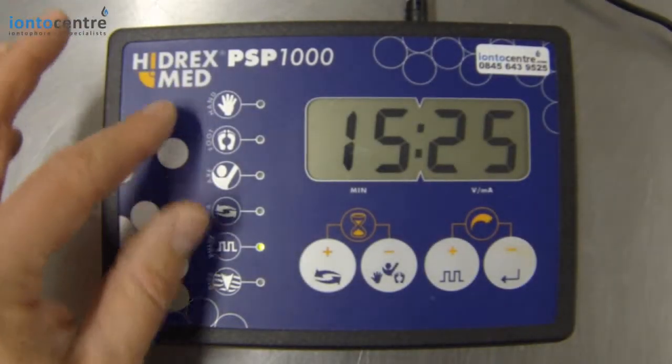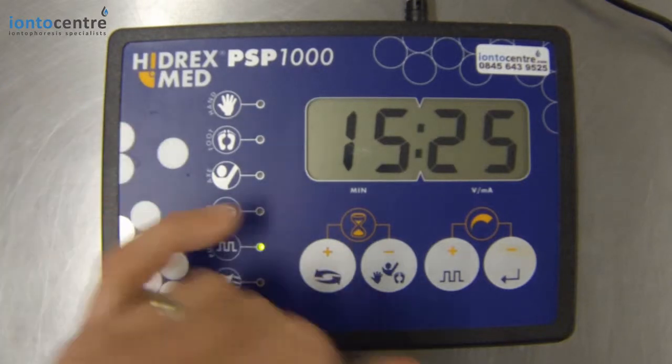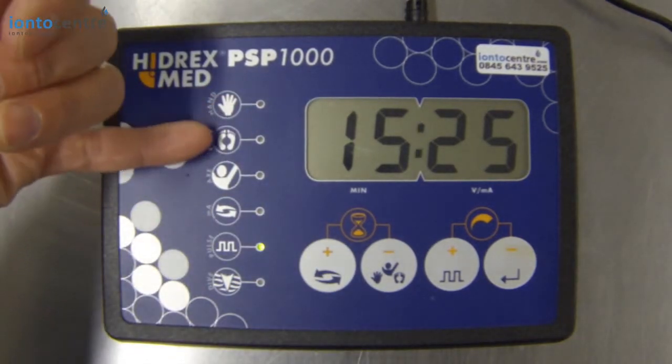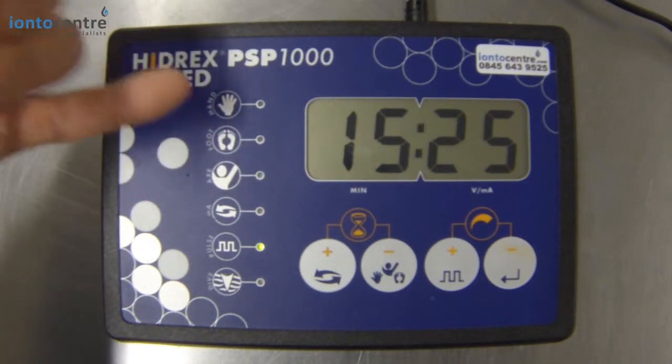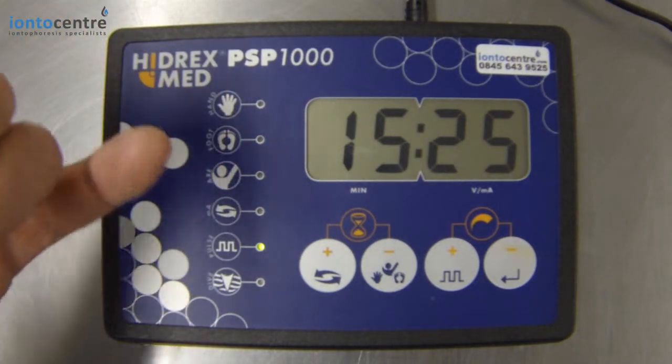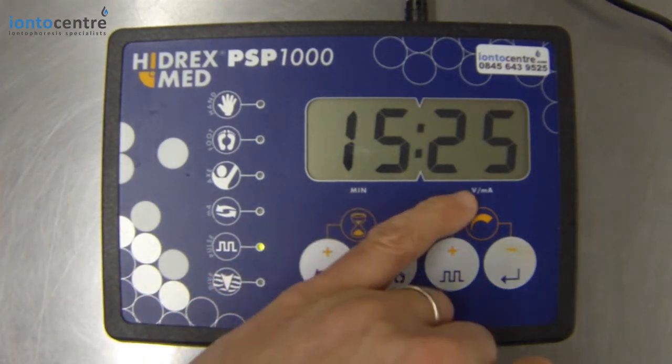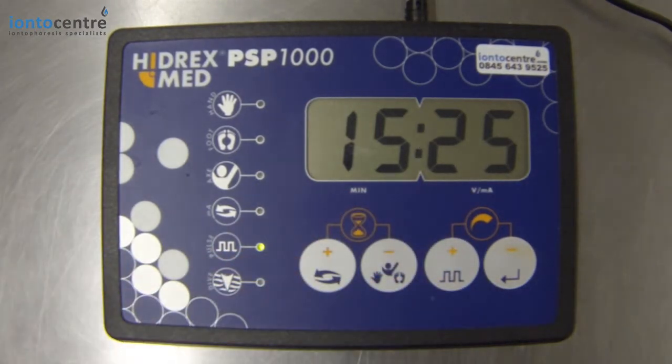While there are presets on the machine, you don't have to use them. If the LED indicators are off, that's telling you you're not using one of your preset values for each treatment area. You can just go straight into treatment mode and just set your time and your power to treat whatever area of the body you need.